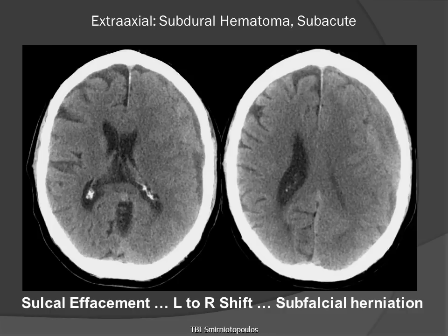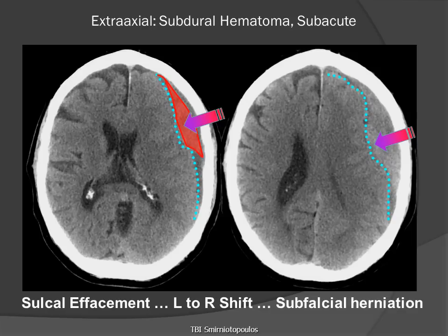which appear to be effaced over the patient's left hemisphere. There is also an extra-axial collection that is almost isoattenuating to the underlying gray matter. We can see the interface between the extra-axial subacute subdural hematoma and the underlying brain. The hematoma is pressing on the brain, but because of the pre-existing enlargement of the subarachnoid space, there is relatively little displacement and shift of the ventricles.